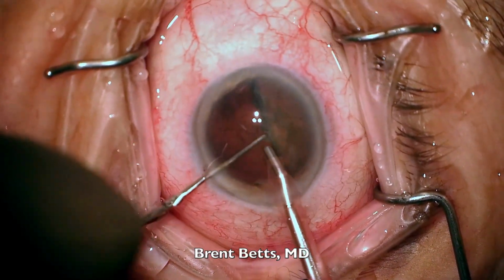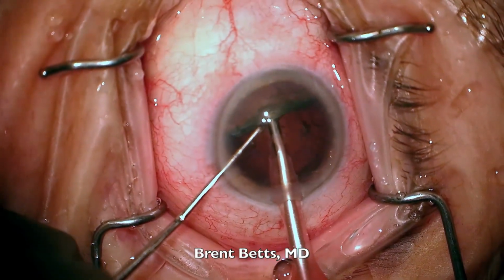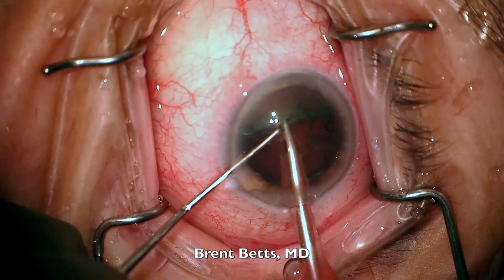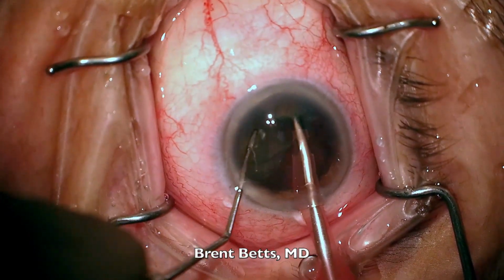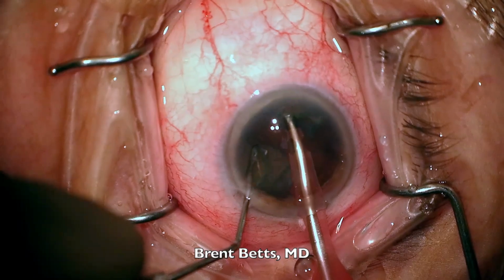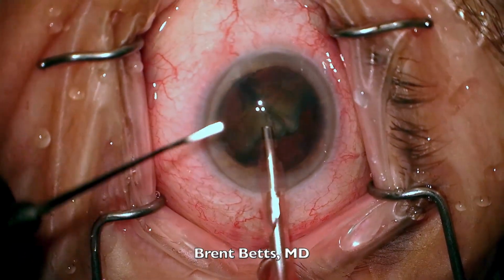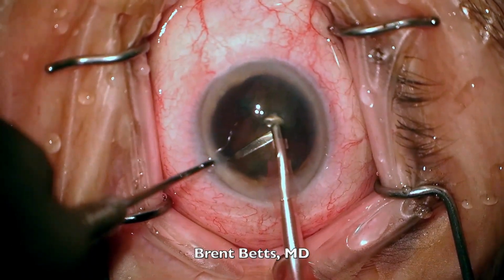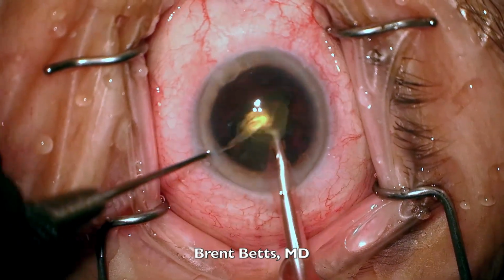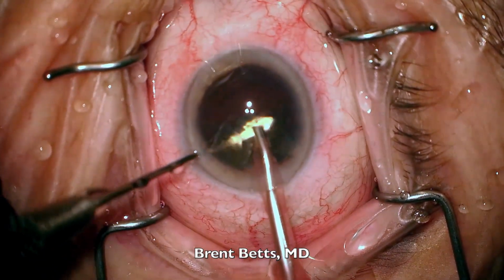Half the cataract is removed at this point. I rotate the cataract in order to make it easier to remove again. I'll use a little ultrasound energy to grab the cataract and then use my chopper to break it in half. My chopper is a double-ended chopper. The other end is a spatula called a Koch spatula. I like to use this for the last parts of the cataract surgery once it's all broken up. I think it's better for protecting the posterior capsule.